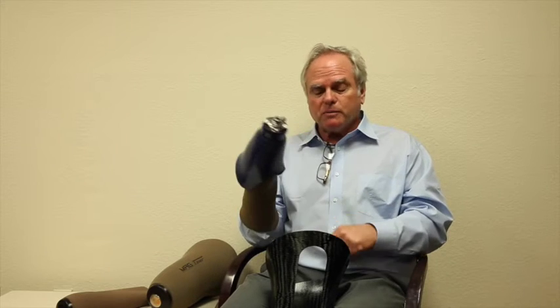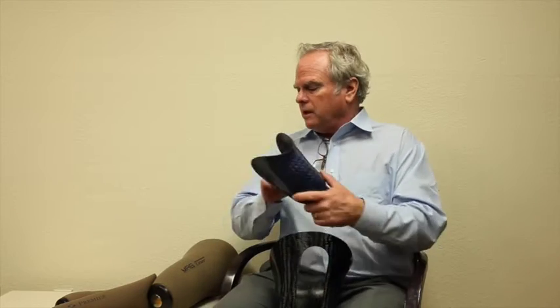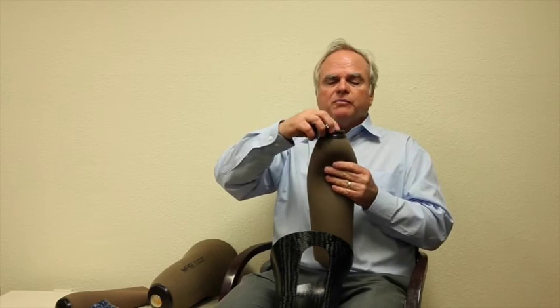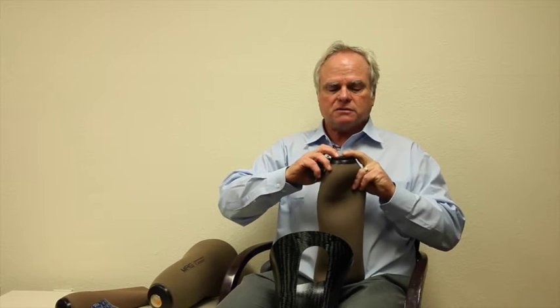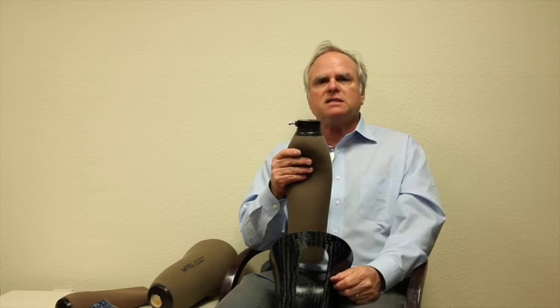Now, back to the purpose of this video, talking about how do I fabricate this? What is the best way? Well, there's a difference between AK and BK only in the sense of big socket, small socket. Same lock, same adhesion, same fabricating process. When you are casting, I'm going to go with the easiest and then we'll go from there: use this little silicone ring, put it on the mag liner, then put the dummy on correctly, Dave. By the way, just for fun, the dummy does have a little tiny magnet, so it holds it in position. If you cast in this position, your spacing and your alignment to the liner is perfect. It's not going to have any issues.